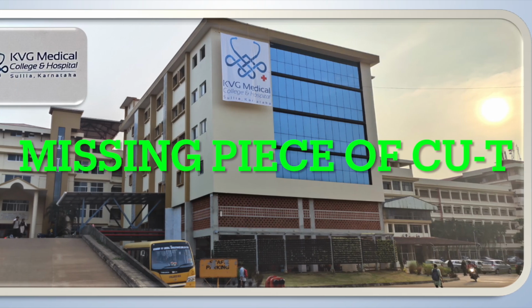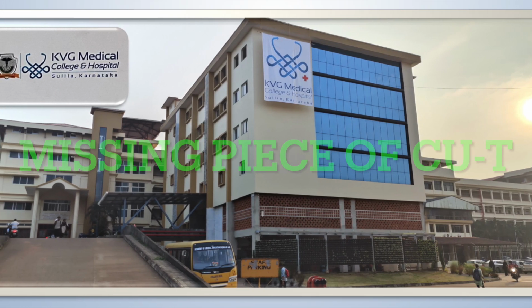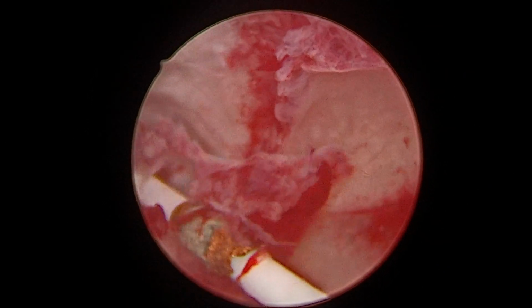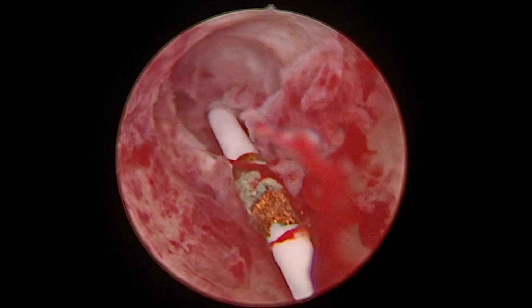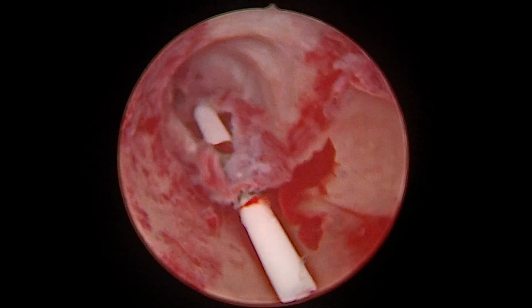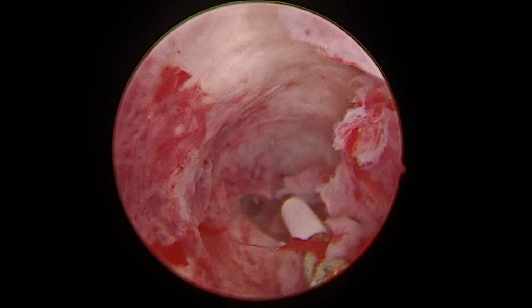Hello friends, I am presenting a case of a missing piece of copper T. A multiparous woman had a history of copper T placed 10 years back, which was removed. But later, when she had abdominal pain for which an ultrasound was done, it showed a piece of copper T, not the complete length, one arm of the copper T retained in the uterine cavity.